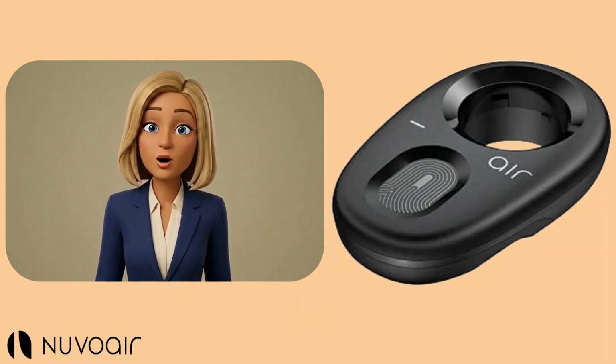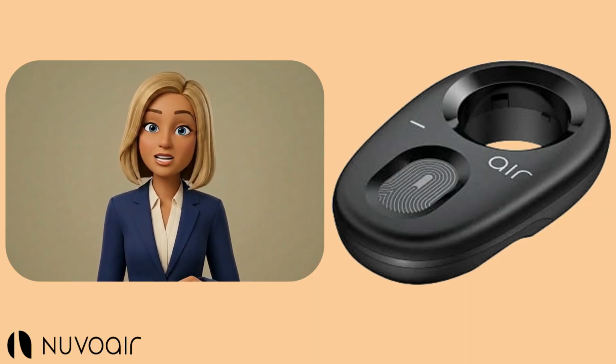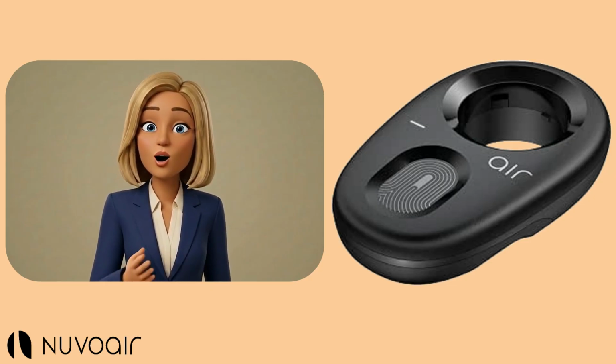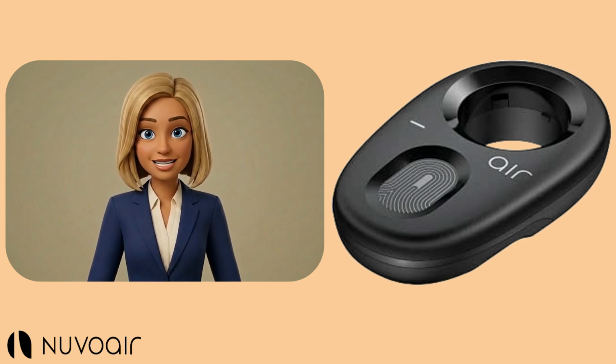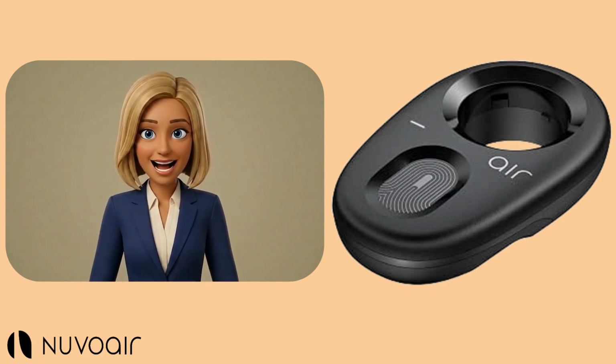Some general things to remember is to update your device and the app when prompted. That will keep things running smoothly. If you get a new device, just download the NuvoAir Home app on there and it should work seamlessly. Please give us a call or send us a text if we can be of any help.